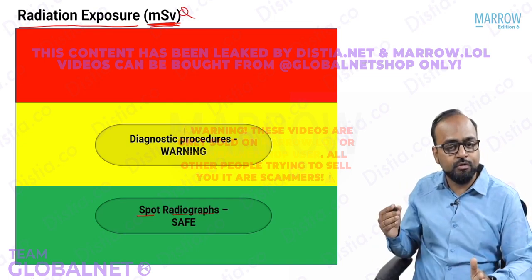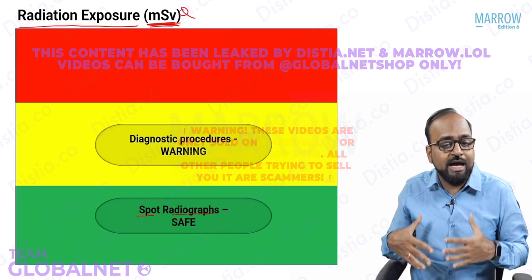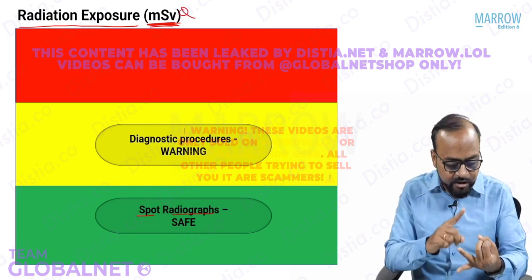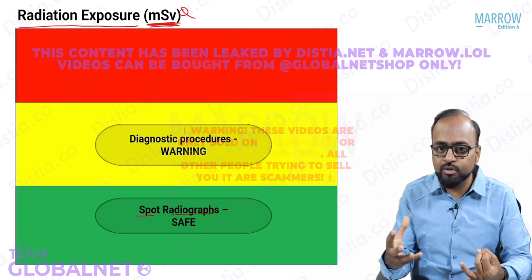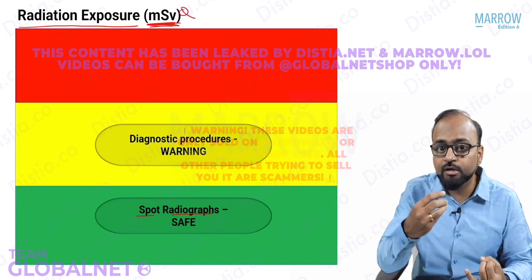But in diagnostic procedures, how do you do an IVU? First, we take an X-ray abdomen to look for renal calculi. See, 1 exposure. Then we inject contrast intravenously. As soon as we inject contrast, we take another exposure, 2 exposures. Then that contrast goes into the arteries, renal artery, comes to the kidney, gets filtered at the glomerulus, renal tubules, renal pelvis, calyces, pelvis, ureter, bladder is opacified.